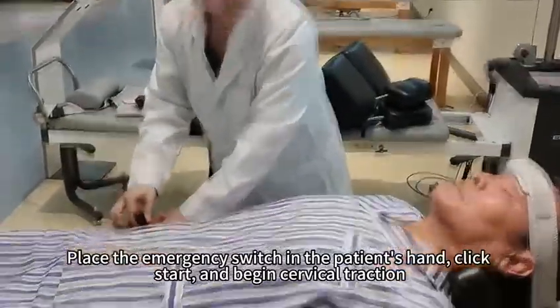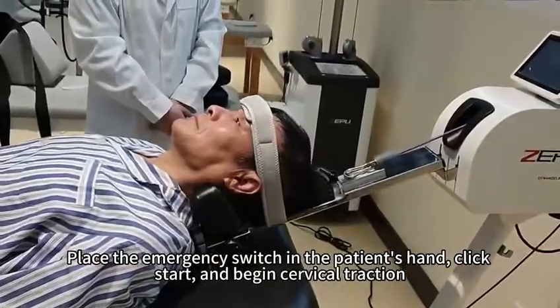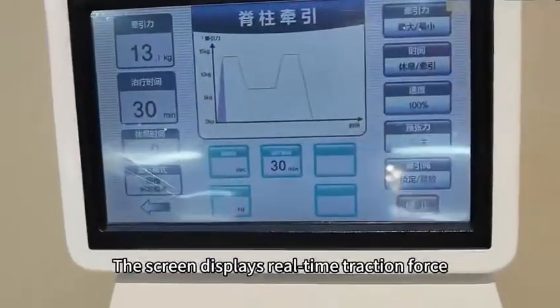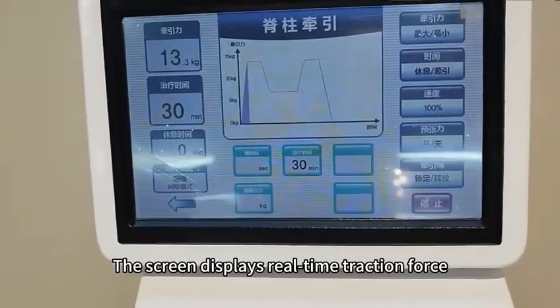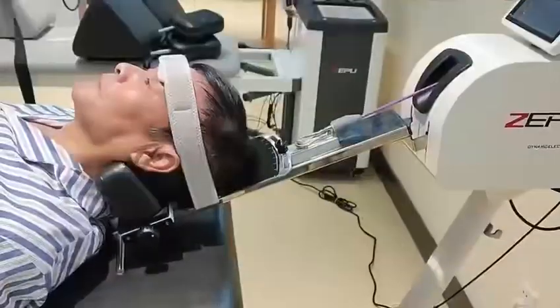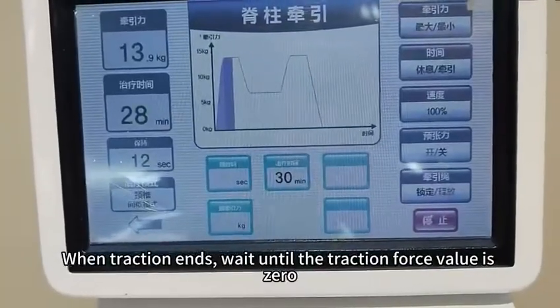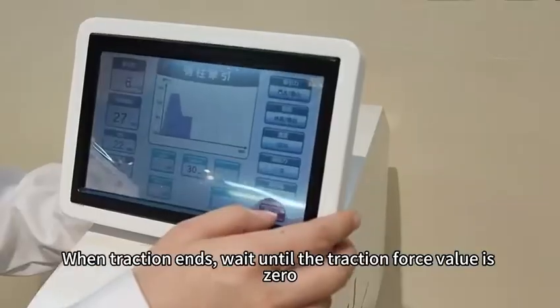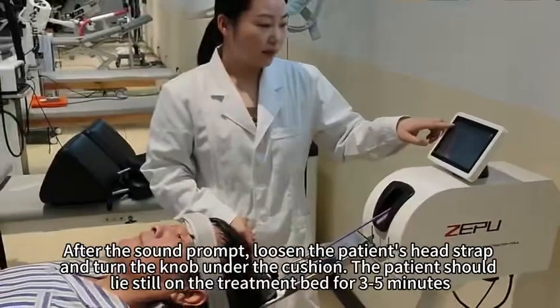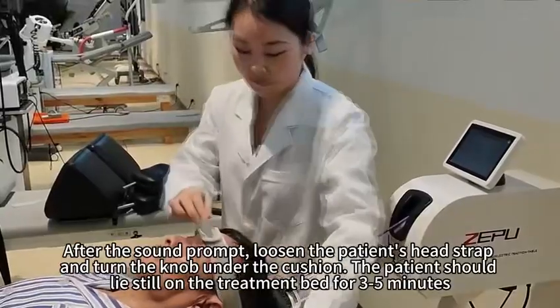Place the emergency switch in the patient's hand, click Start, and begin cervical traction. The screen displays real-time traction force. When traction ends, wait until the traction force value is 0. After the sound prompt, loosen the patient's head strap and turn the knob under the cushion.